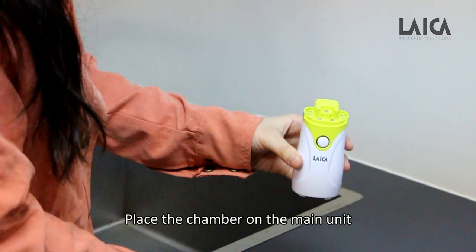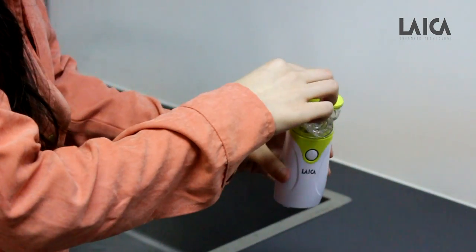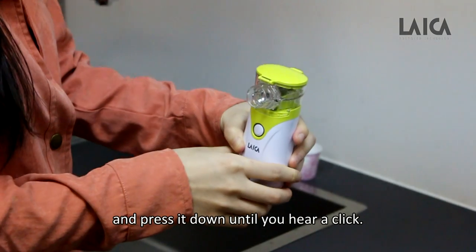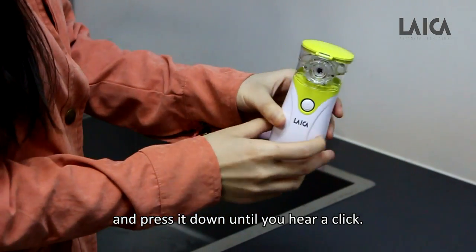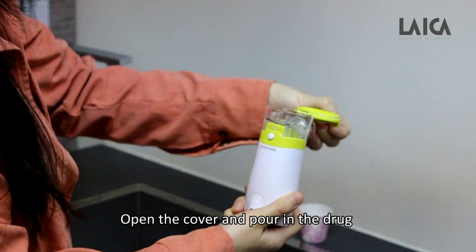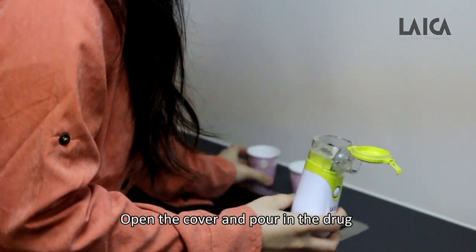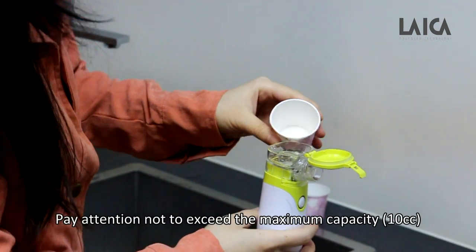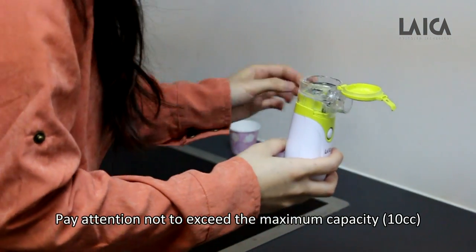Place the chamber on the main unit and press it down until you hear a click. Open the cover and pour in the medication, paying attention not to exceed the maximum capacity of 10 cc.